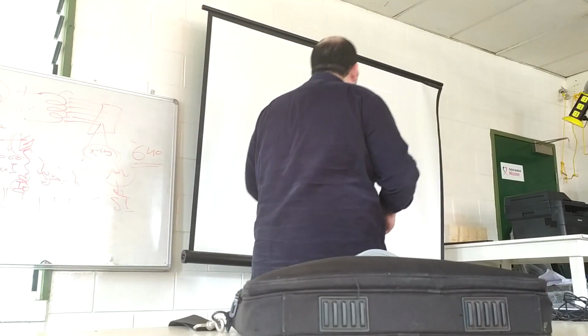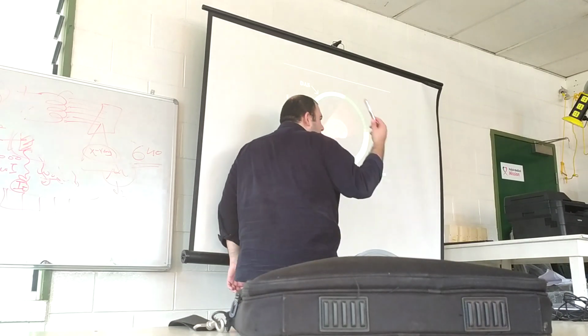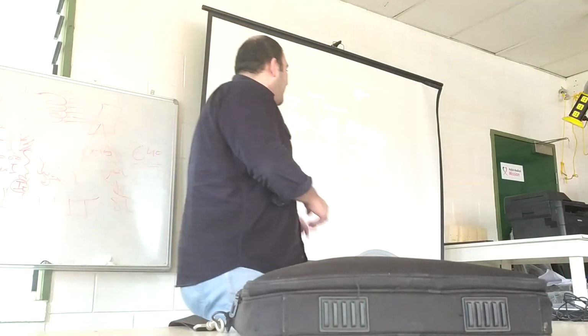But here in the fifth generation, we are not using one anode. We are using 4 anodes. Why? To increase the width of the beam, to cover a large area of the patient, so you can scan a large area of the patient at the same time. This is the fifth generation. It's very expensive.